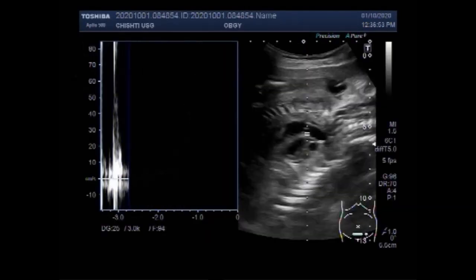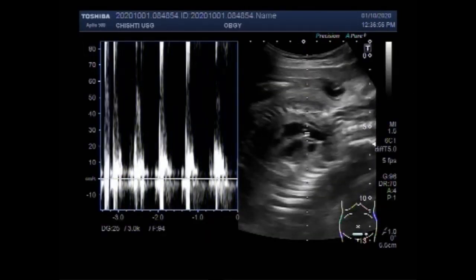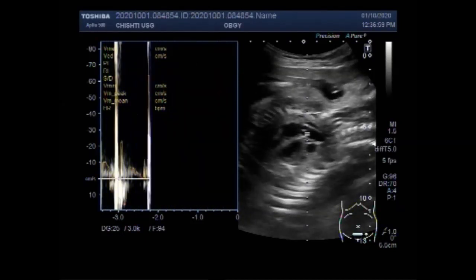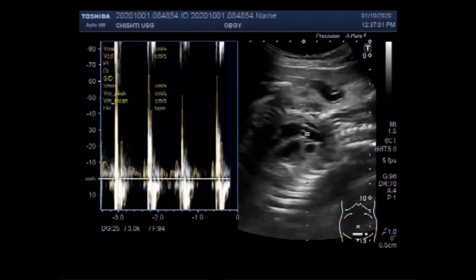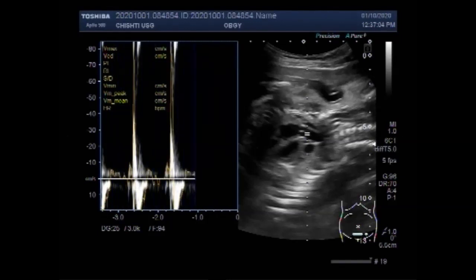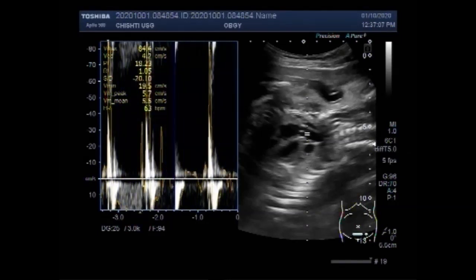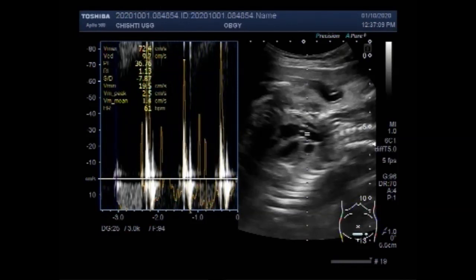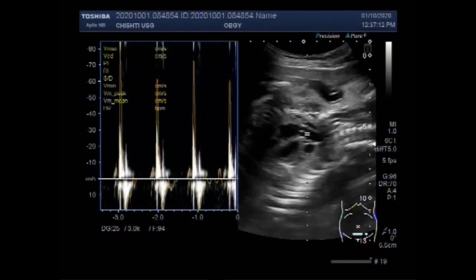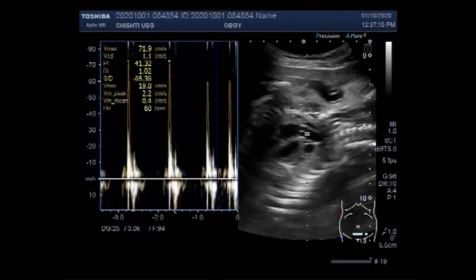Now you can see the fetal cardiac activity and you will see the difference. The fetal cardiac activity shows bradycardia. You can see the fetal heart rate, and then after a while it may become normal.